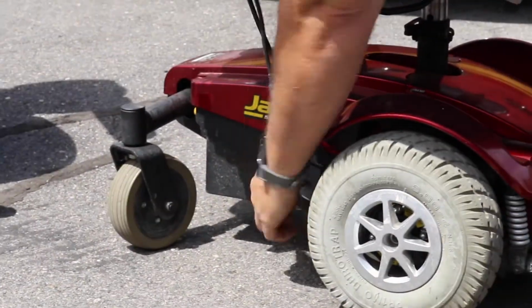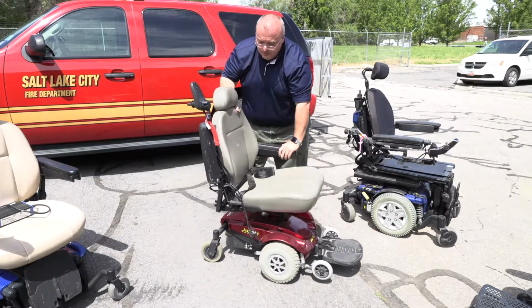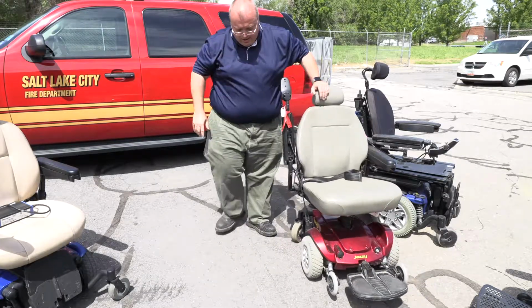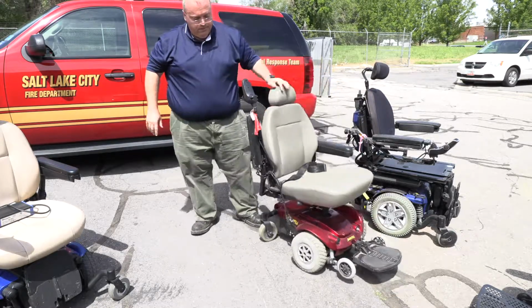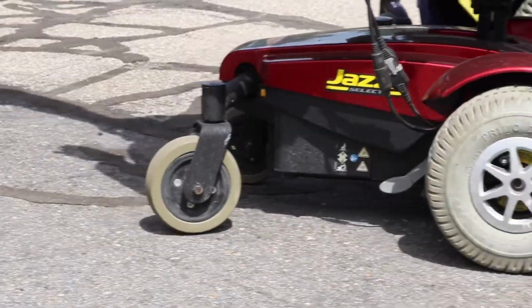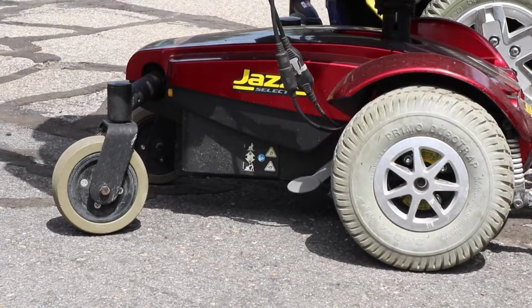These levers, this is not in freewheel now, not moving. These levers are quite unique. You notice this little diagram, and this is in freewheel, okay? Quite a unique thing. I would not try and do this with your foot. Those are very easily broken. You can break those off and cause somebody some serious repair costs by doing that.